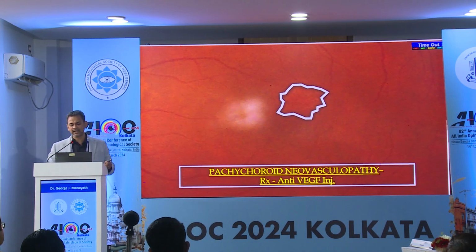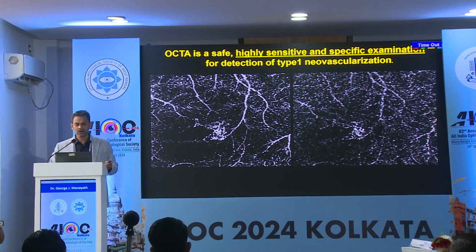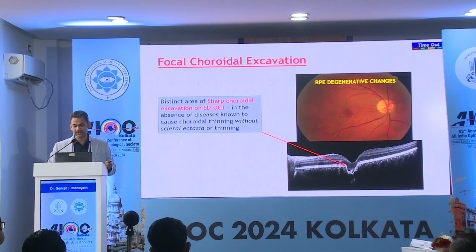It overlies the area of flat or shallow irregular PED, giving a diagnosis of pachy neovasculopathy, so not PDT but anti-VEGF therapy with a fewer number of injections. So OCTA is highly sensitive and specific for this indication.